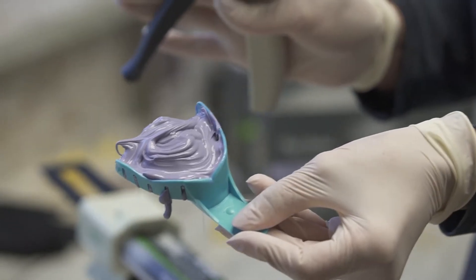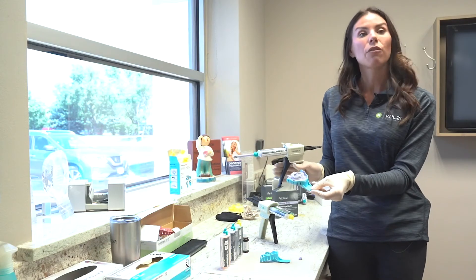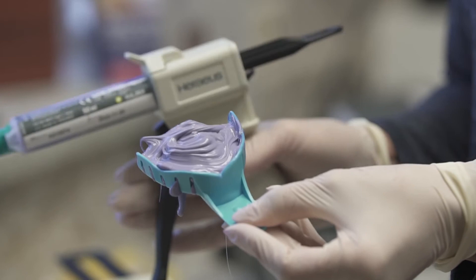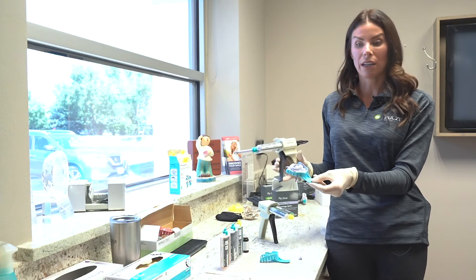Now we have our heavy body tray loaded. The nice part about Flexi Time is that you have a flexible working time of two minutes and 30 seconds. If you don't need all of it and you're ready to place the tray a minute after mixing, your working time is over and then you have a set time of two minutes and 30 seconds.